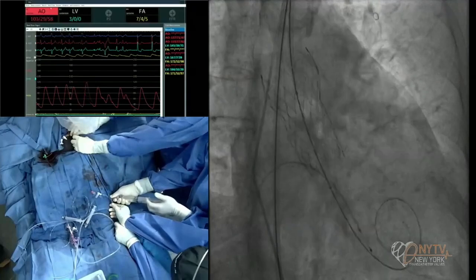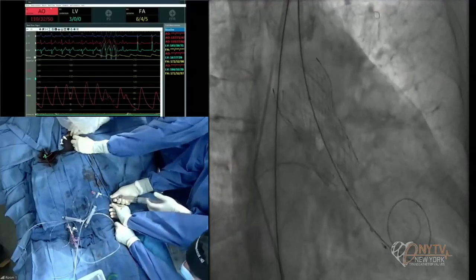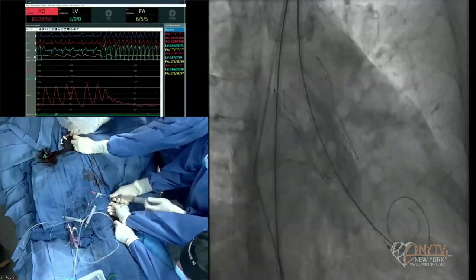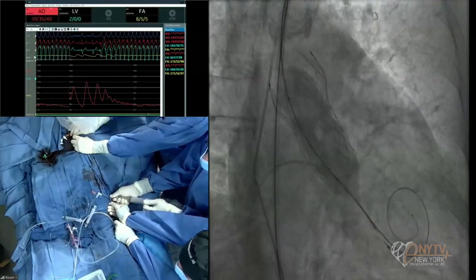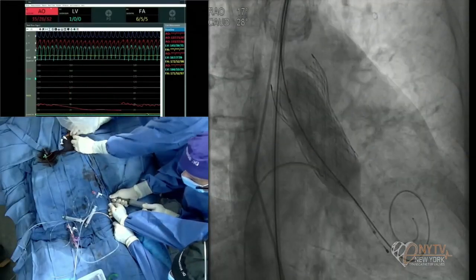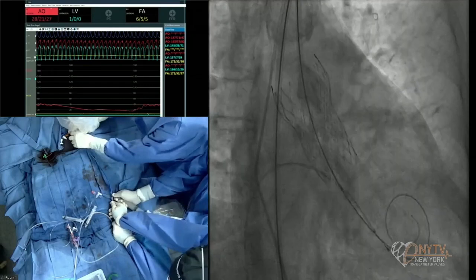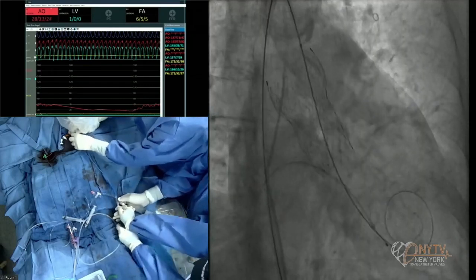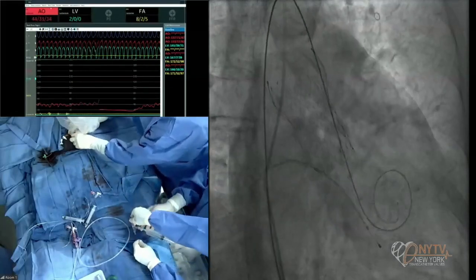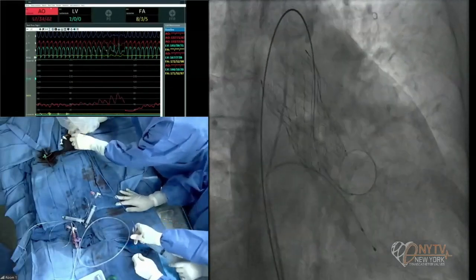Okay, slowly we are going up. Make sure you go a little bit more in. Okay, go. Good. Go. This one you can go fast. Okay, go slow. That's it. Full. Yeah, full. It definitely expanded more down there. It definitely did. Looks better. Good. Get the picture again. Okay, off the pacemaker. Yeah, very good. No, off. Stop the pacemaker.